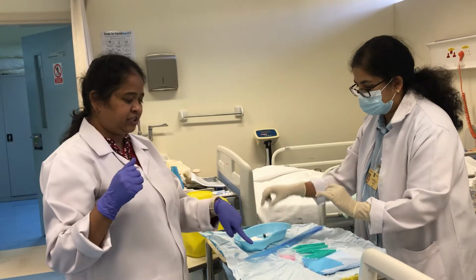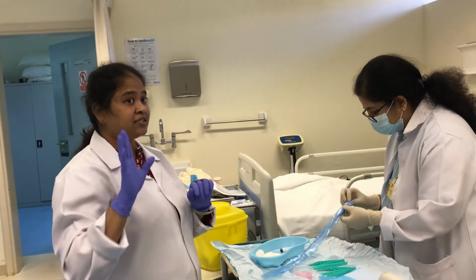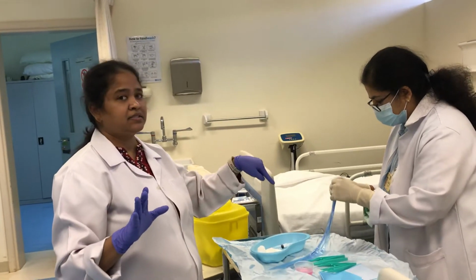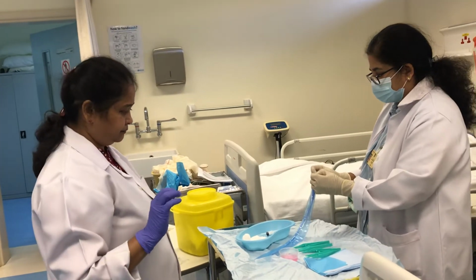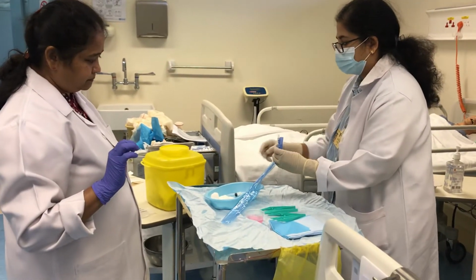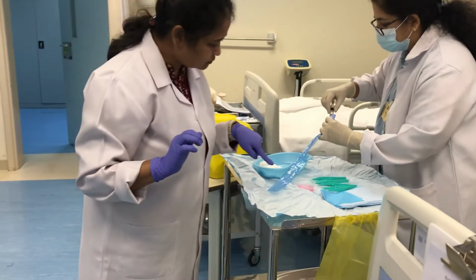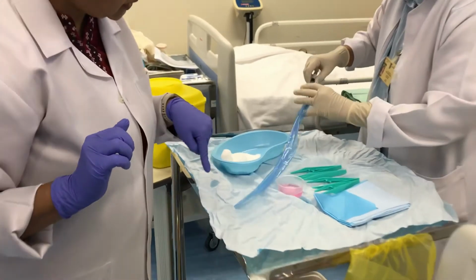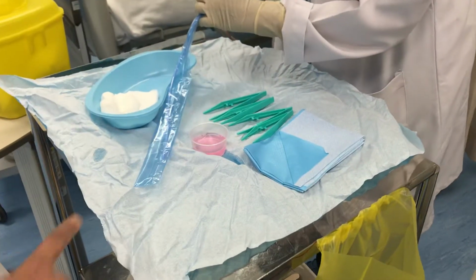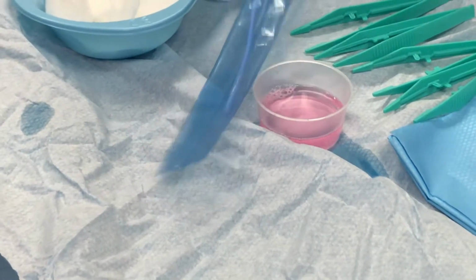First step is we are checking whether the balloon is working or not. There are many catheters where it doesn't work. That is why we are taking this step first. Hold on, from down. Not touching the catheter as such. We have to check whether it should bulge. It is not fixed. You just have to keep it there.